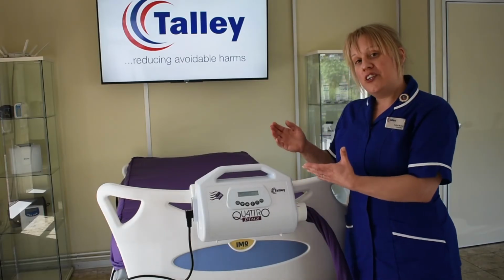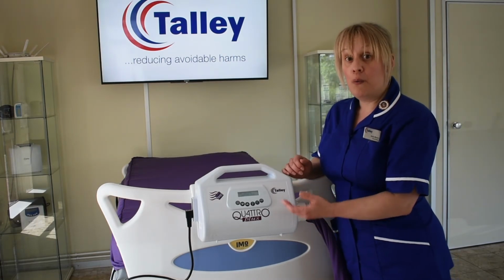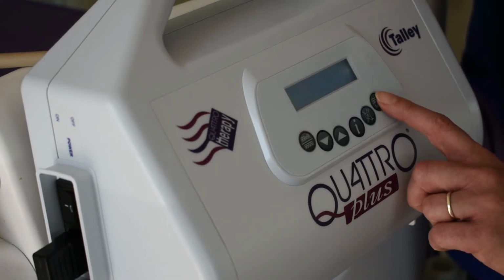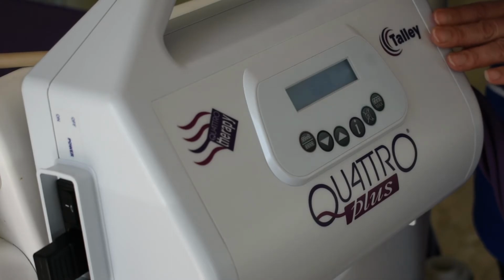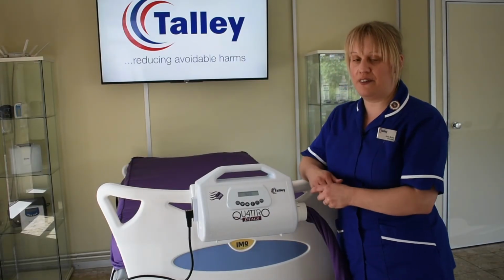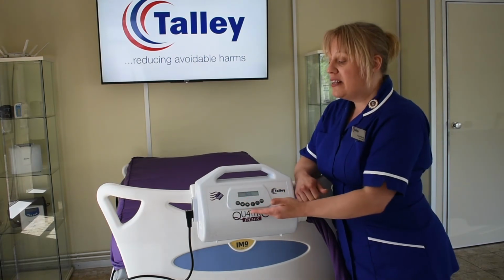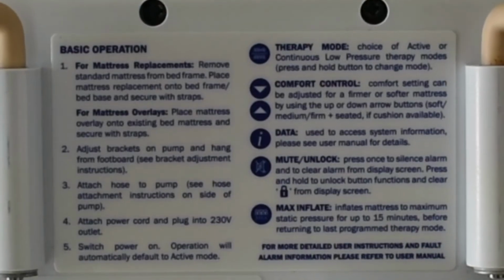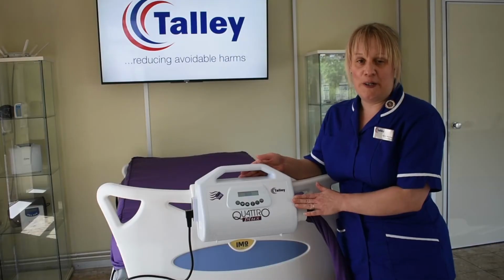Now, if we'd finished with the max inflate mode before the 15 minutes is up, we can manually change it back. So we would just press the max button once and it will bring it back down to whatever setting we had it on previously. If you need more time, then you just press the max inflate button again and it will re-inflate it for a further 15 minutes. So that's all of the buttons and the functions of the power unit explained. If you need any more information, just look at the back of the power unit because all the buttons are explained on the back.